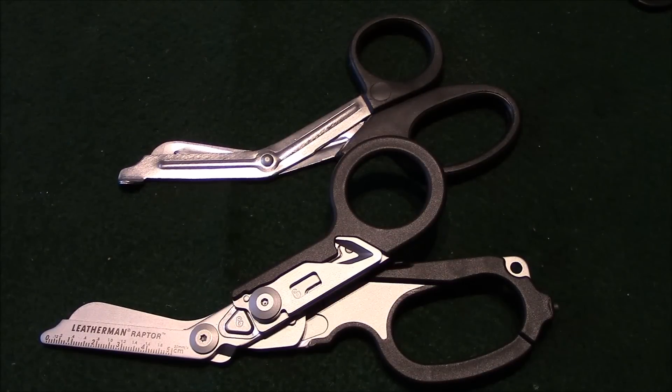Hey guys, this is Anthony with Training with AJ, and today is going to be a quick review on my Leatherman Raptor. This is a must-have tool for any EMT, nurse, doctor, or especially a military medic.